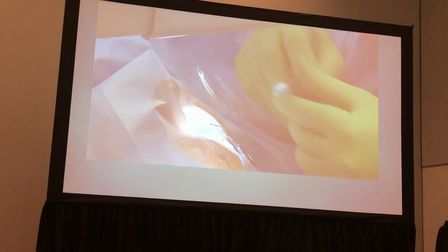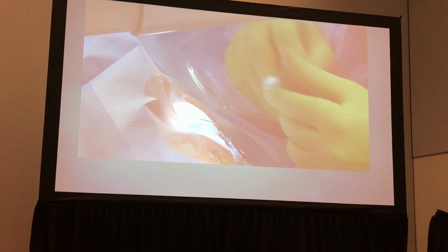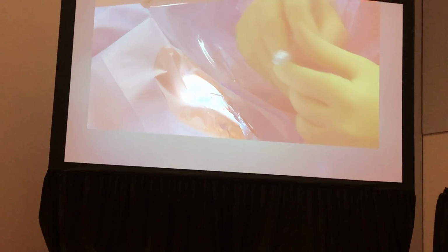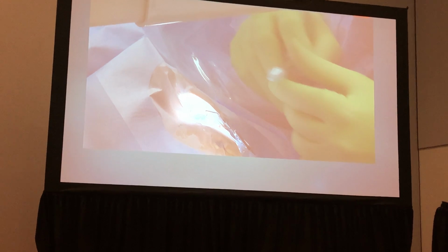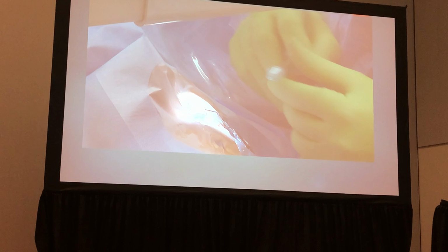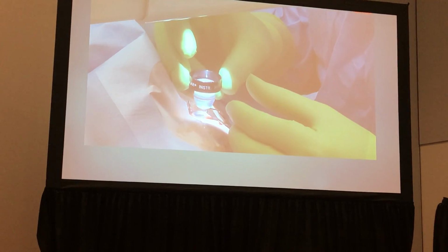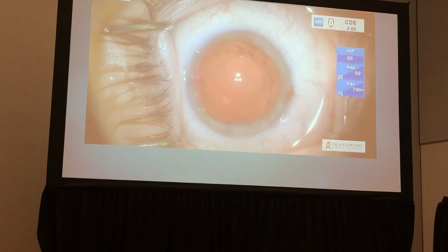All right, so there's an example of using Aura, and that gives you a true refraction. So we always talk about anterior and posterior corneal curvatures, and you can estimate them. A lot of people don't have equipment to actually measure a true K. But Aura will do it for you because you're actually getting a refraction. And we calculated right around a 16 diopter lens for Plano for her, but I definitely trust the Aura more than I trust my measurements. We've been more accurate with it, so we're going to check it.